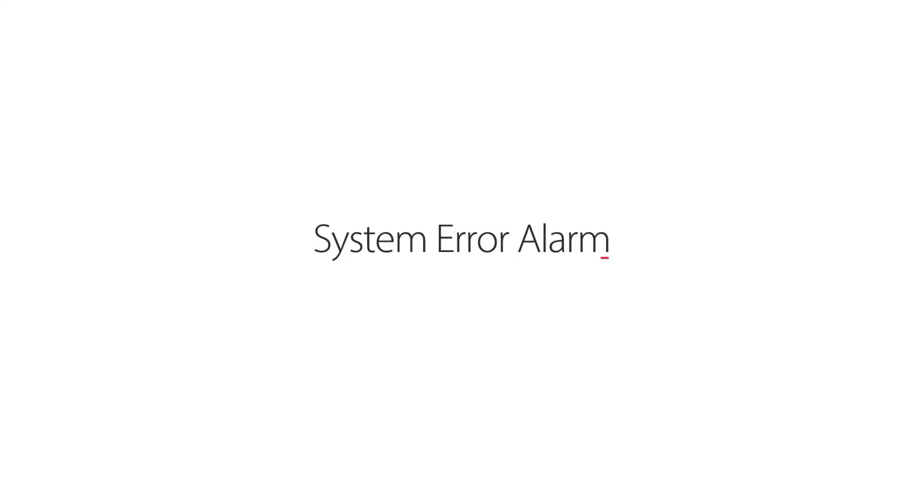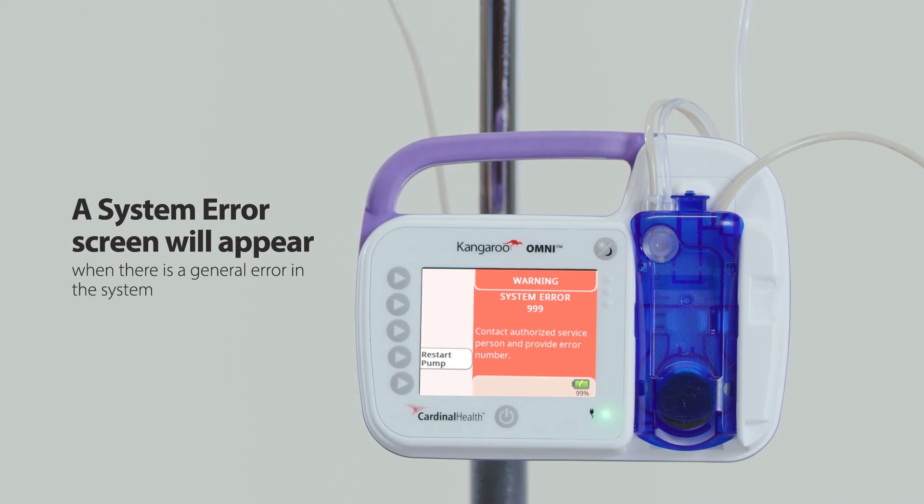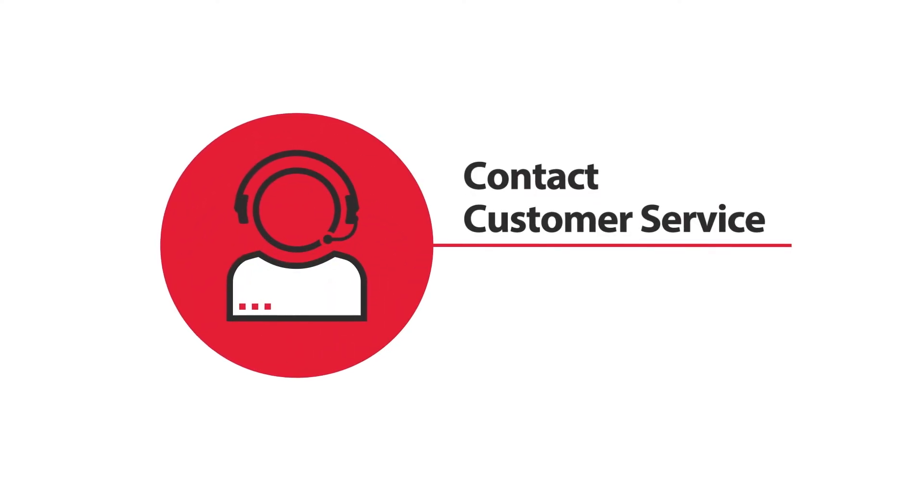System error alarm: a system error screen will appear when there is a general error in the system of the Kangaroo Omni enteral feeding pump. To resolve the alarm, press restart pump. If the alarm is not resolved after restarting the pump, please contact customer service.